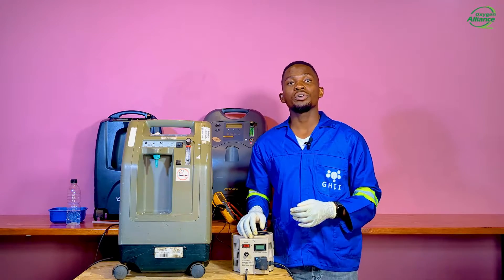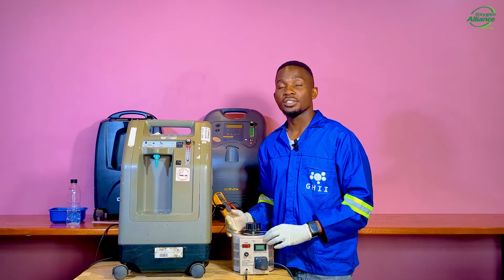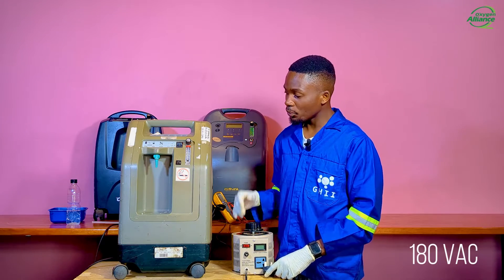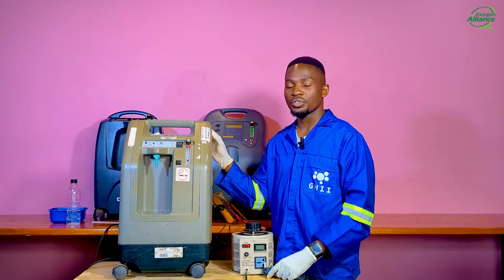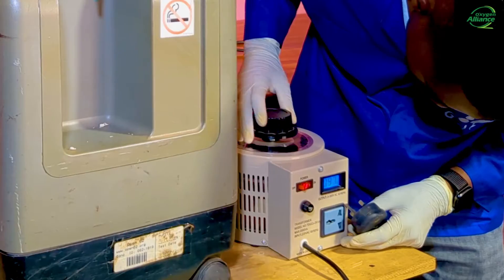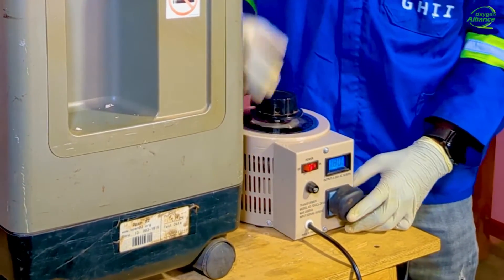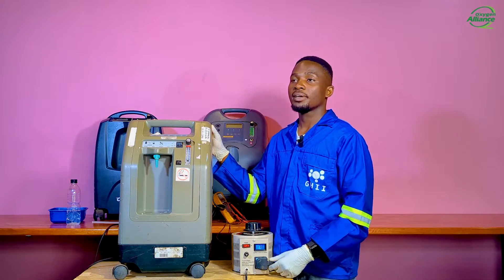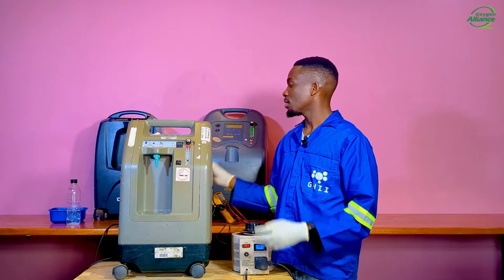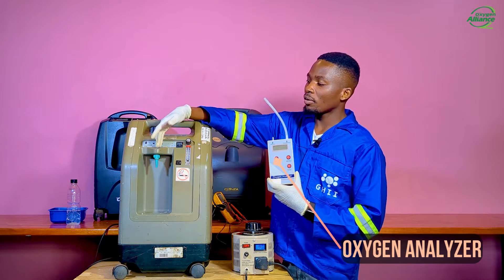To simulate a low voltage situation, I will use this variable transformer which has the ability to vary voltage from 0 volts to 300 volts, and I will set it at 180 volts, which is less than the rated voltage of this oxygen concentrator. Now I will power on the machine and let it run for about five minutes. Then, using this ultrasonic oxygen analyzer, I will measure the oxygen purity out of the oxygen outlet port.